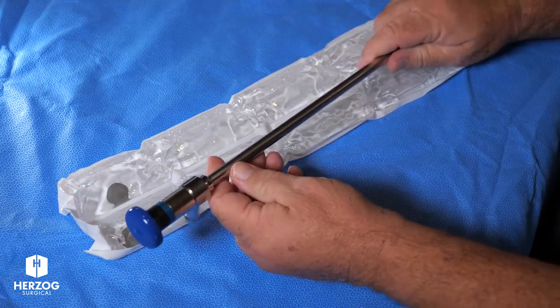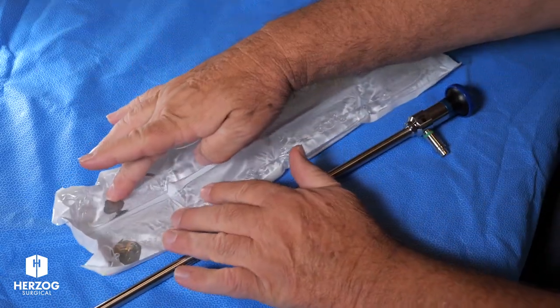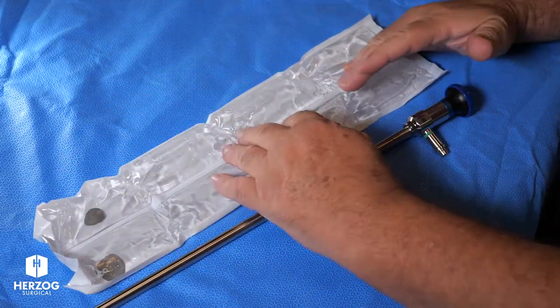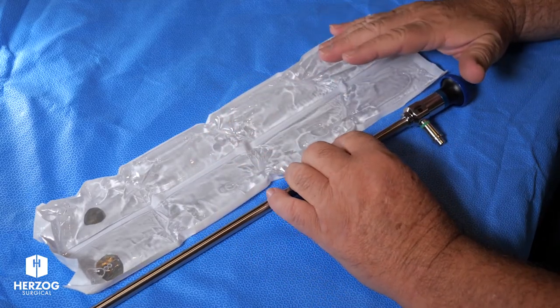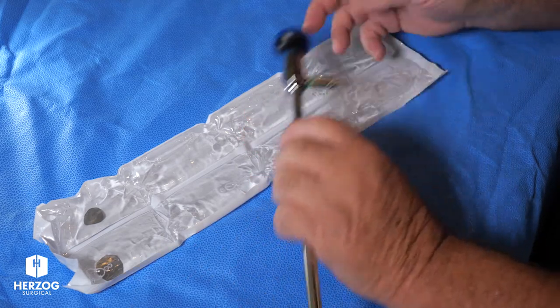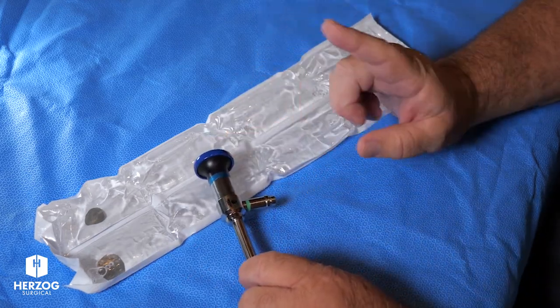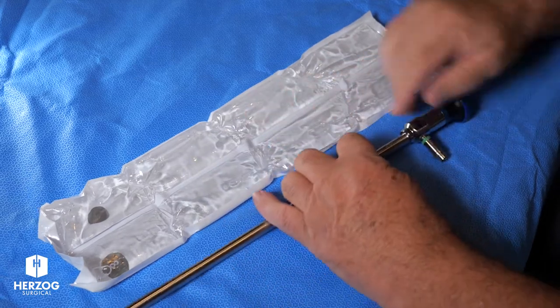The way hospitals have told us they use this best is: they'll activate it, put the scope in here, and wrap it up in a towel. As long as you've got it in there for a few minutes, you're going to have a warm scope and will not have condensation. They typically will have their camera on here, their light source, and white balance done.